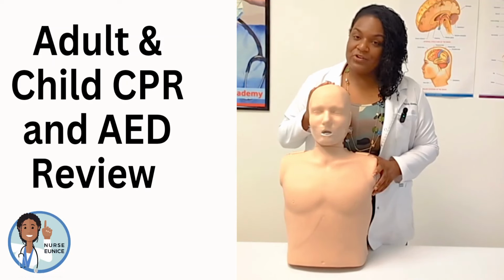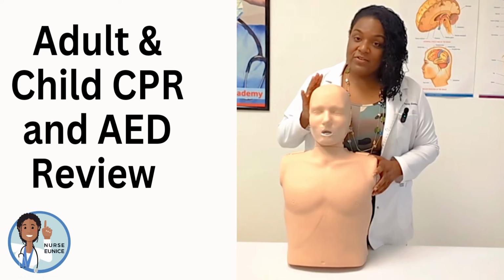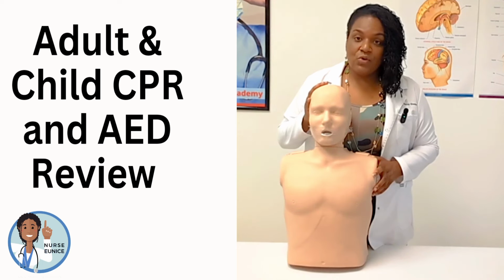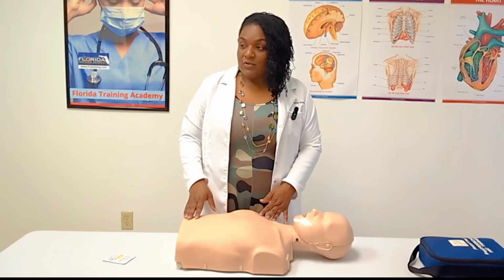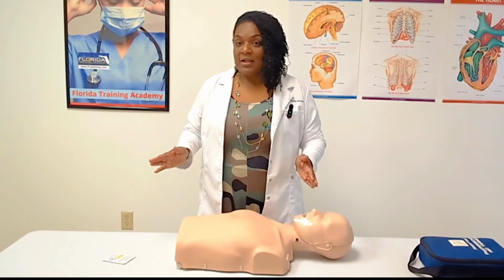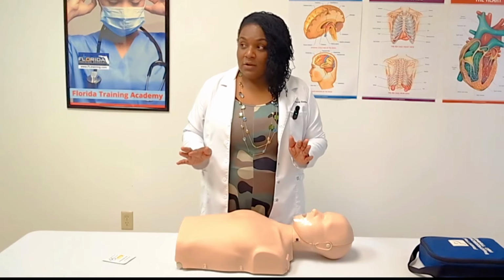In today's video, I'm going to show you how to perform CPR, how to use an AED, and how to provide rescue breaths to an adult or a child victim who is suffering from sudden cardiac arrest. Whenever you see a person who's on the ground, you always want to think about your safety first. So is the scene safe? Look left and look right.